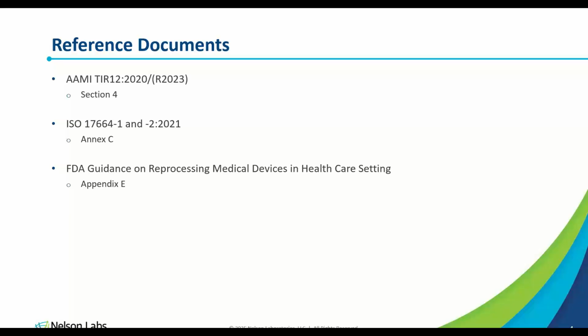You're going to be using more cleaning tools like brushes and syringes or flushing instruments to flush the lumens. You'll be using ultrasonic units, and you'll be using different types of brushes. So not just toothbrush style toothbrushes, but also lumen brushes. If you have different sized lumens, then you'll have different lumen brush sizes that you'll have in your IFU.